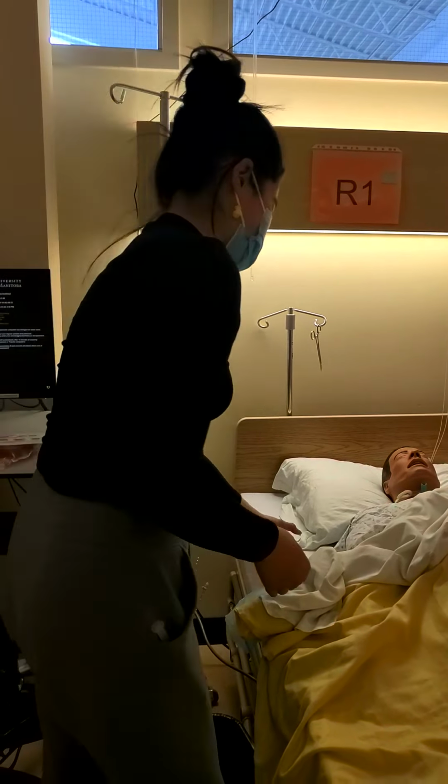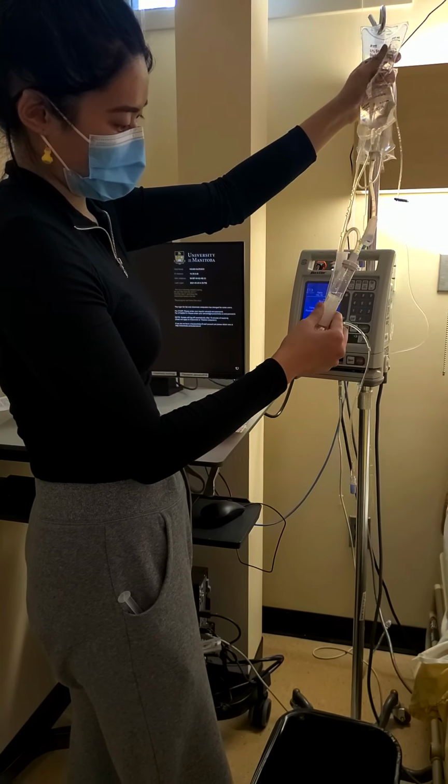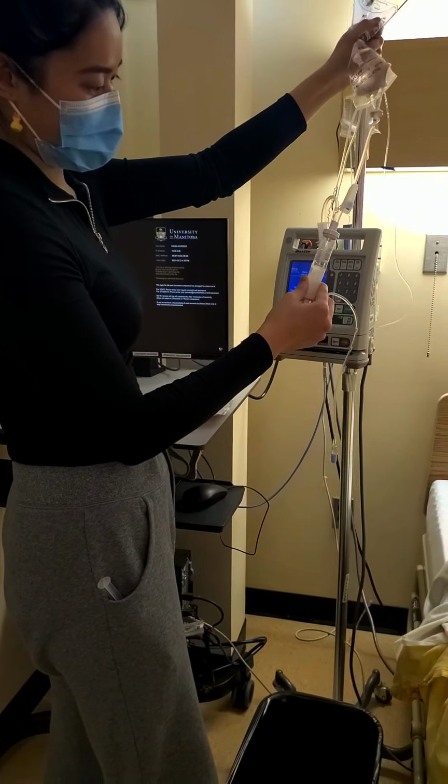I'm just going to squeeze so we can get the Okay, yes. They need a reset. Okay, so now I see that it's primed. Start hanging this. Now I'm going to put it in the cup. So now that we see that it's submerged, we want to make sure there's no bubbles in there. Then I'll clamp it off.